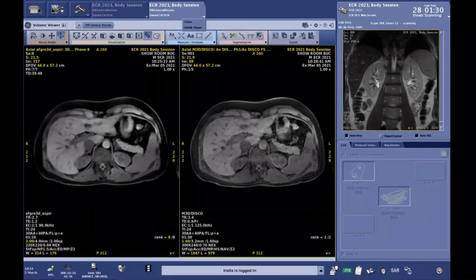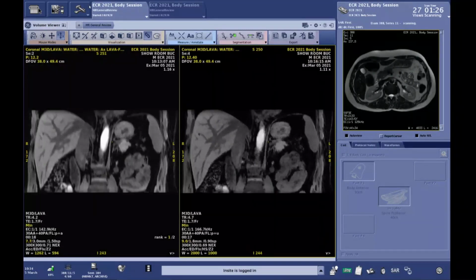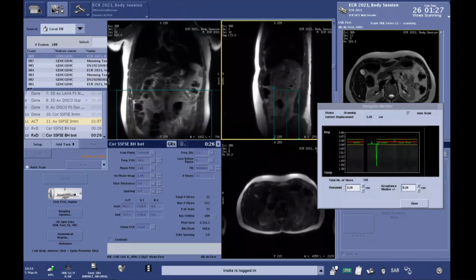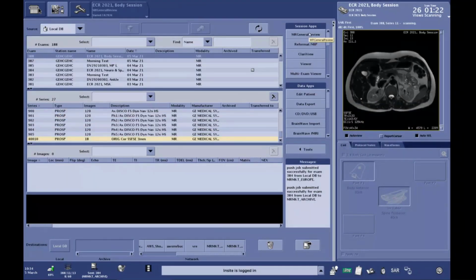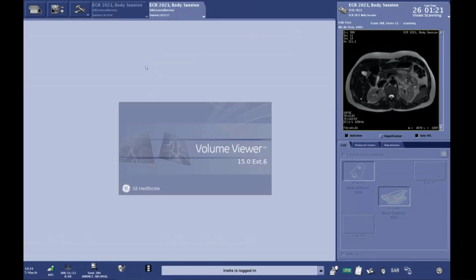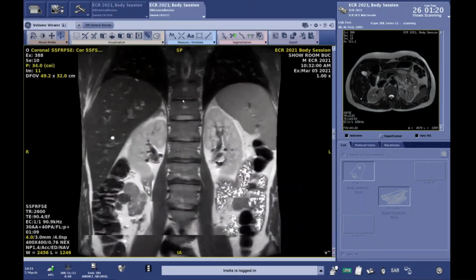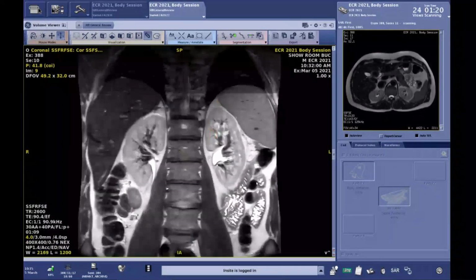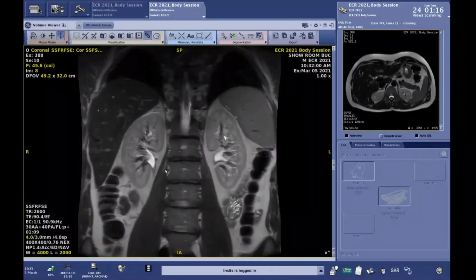You may have thought that it would be too long to spend time on some of the T1 sequences, but as you know, that is the most important sequence when we are doing an abdomen exam. So it is very helpful to have multiple techniques to combat patient motion and to adapt and tailor to any rhythm or patient condition.